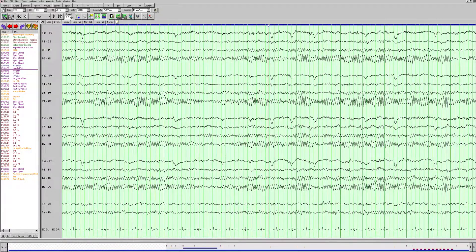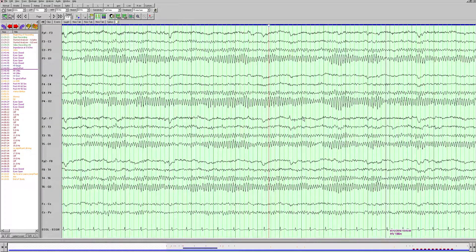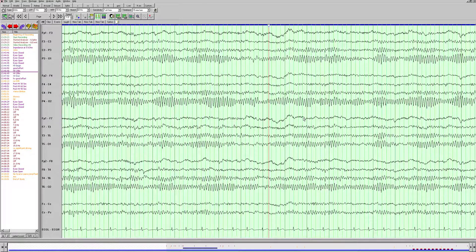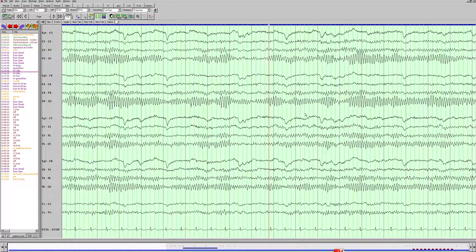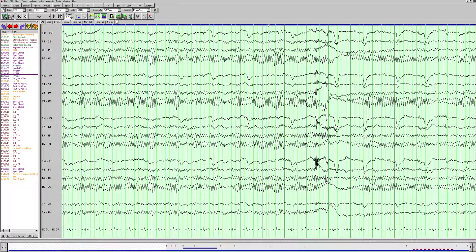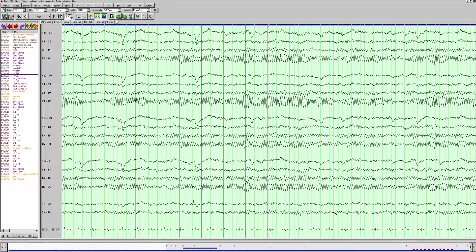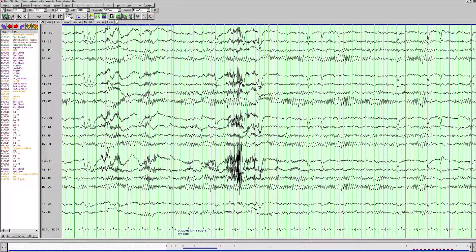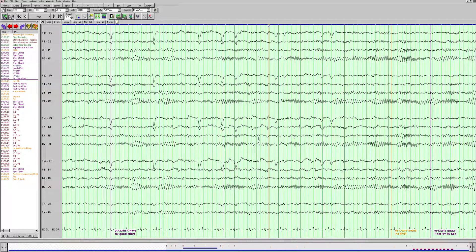Now the patient is hyperventilating, and we're going to see if there's a hyperventilation response. As mentioned in the last video, during hyperventilation we're looking for epileptiform abnormalities, usually in patients with primary generalized epilepsy — but that would be very rare in someone at this age; we usually see that in children with absence epilepsy. We can also see what's called a buildup: high amplitude slow waves during hyperventilation — but that usually happens in the young. We're not really seeing much here. The patient's hyperventilating but the background looks unchanged. The techs usually have patients hyperventilate for three minutes. We're seeing a lot of artifact — lots of muscle movement, little eye blinks, and a lot of eye movements back and forth.